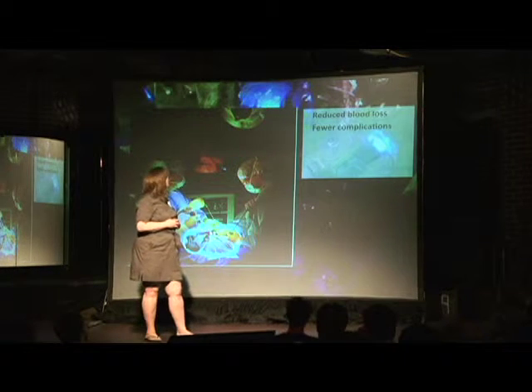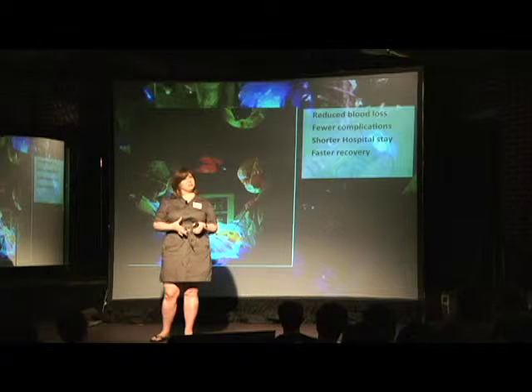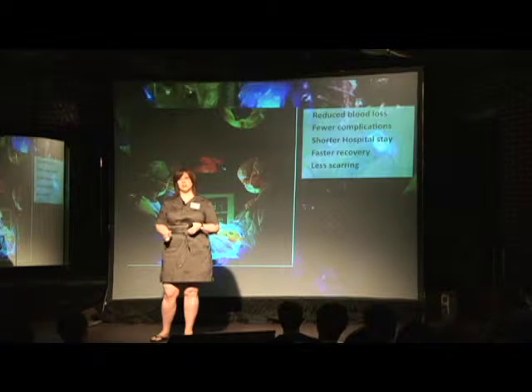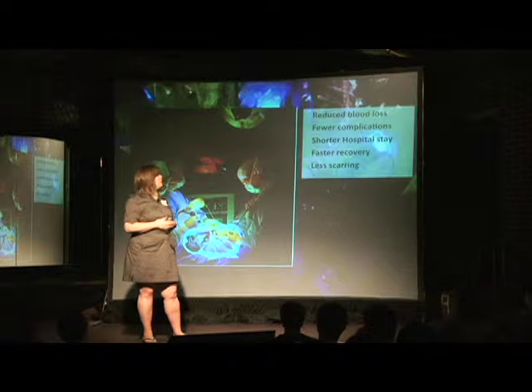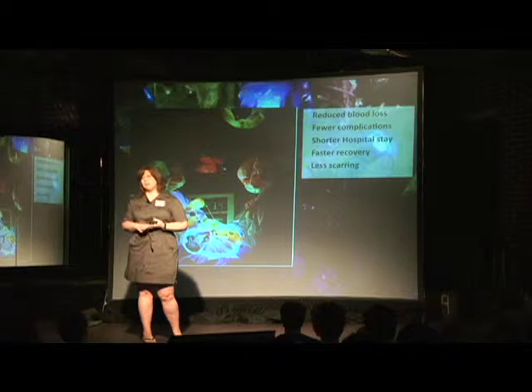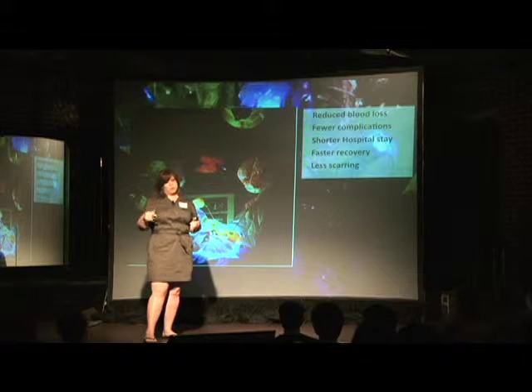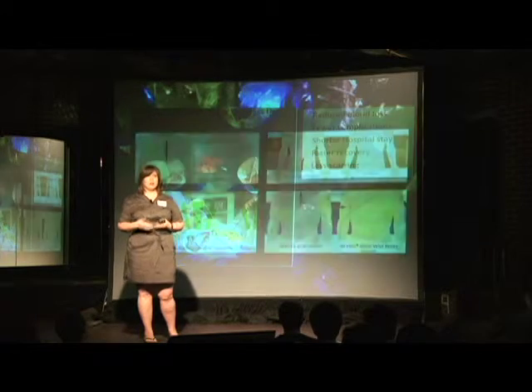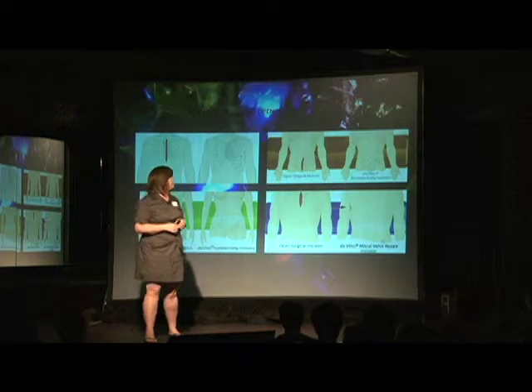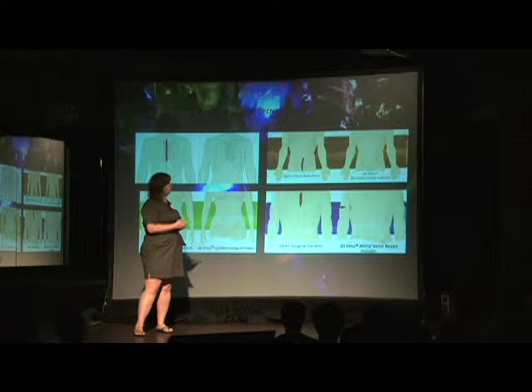And it basically is minimally invasive surgery. In traditional surgeries, you have a larger incision, and that can create a lot of problems for people. You often have increased infection rates. You have longer healing times. With porthole incisions, it really allows for people to get back to life quicker, back to work quicker. Here you see some differences in traditional versus robotic incisions.